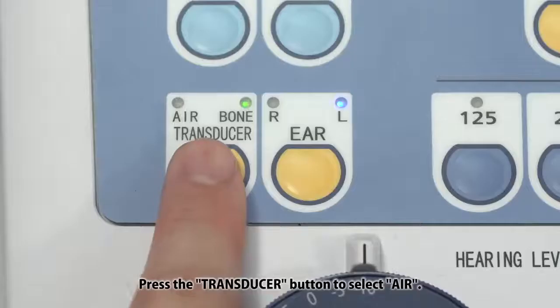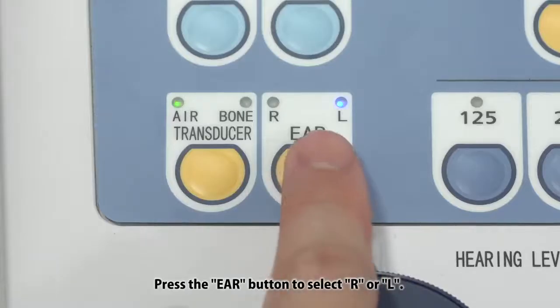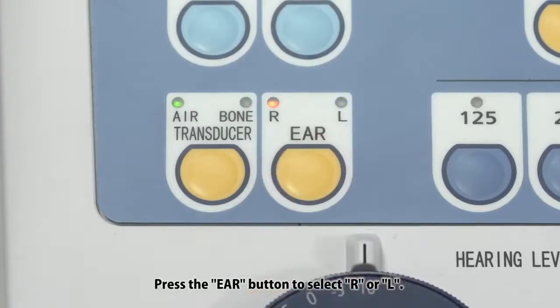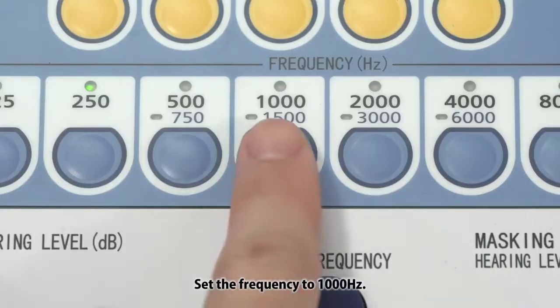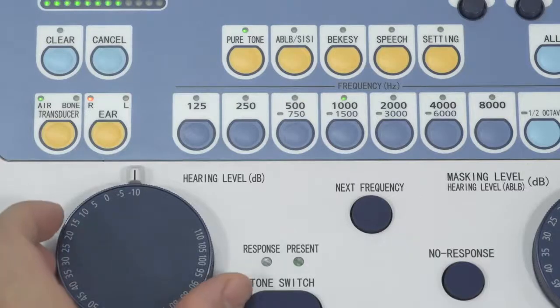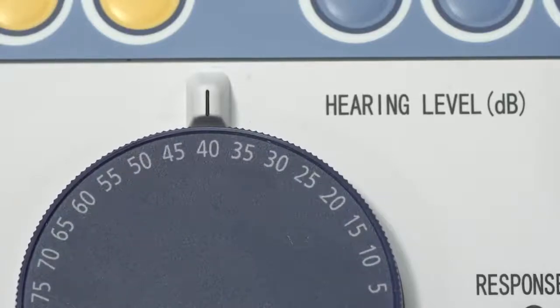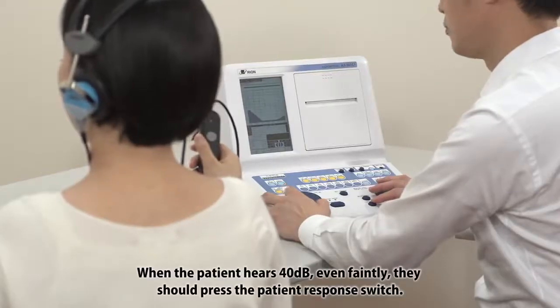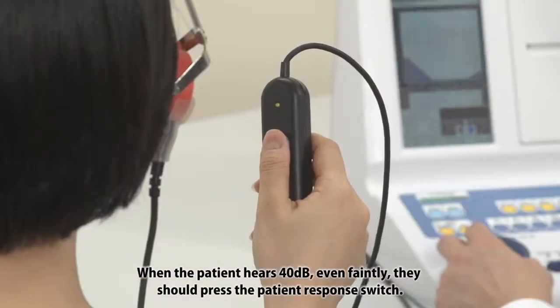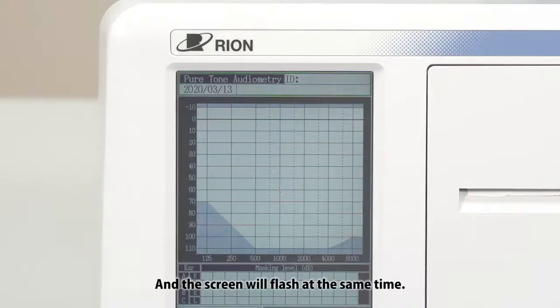Press the transducer button to select air. Press the ear button to select R or L. Set the frequency to 1000 Hz and set the hearing level dial to 40 dB. When the patient hears 40 dB, even faintly, they should press the patient's response switch. The response lamp will light up, and the screen will flash at the same time.